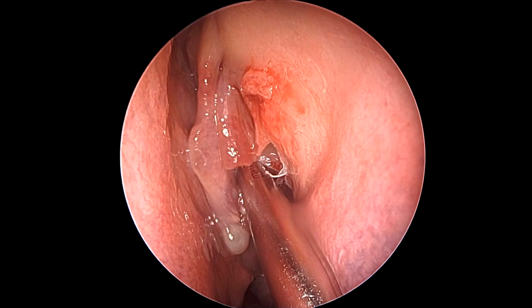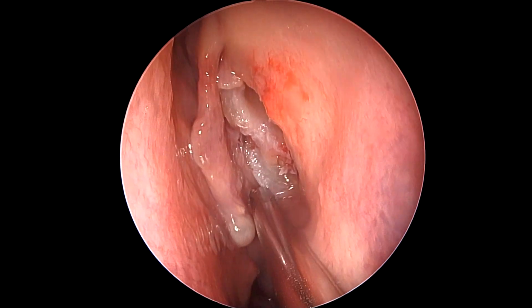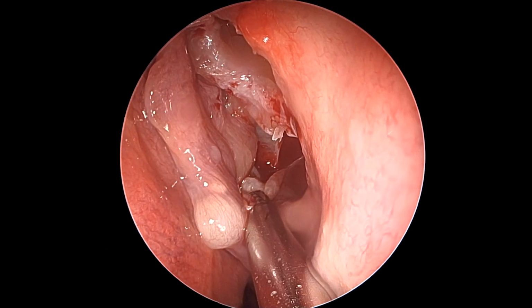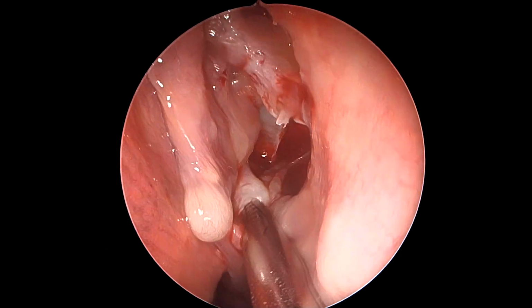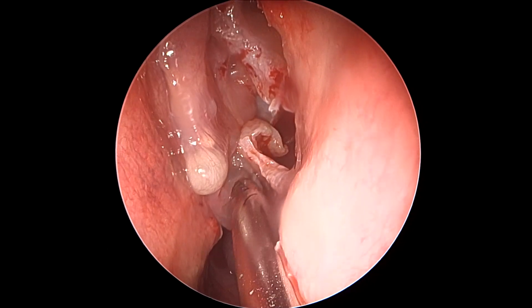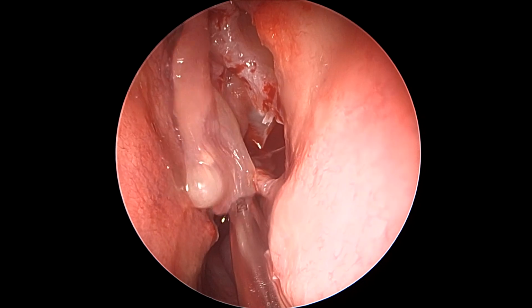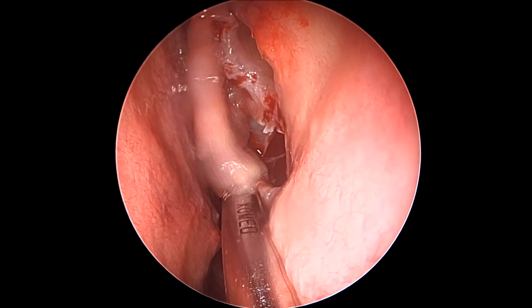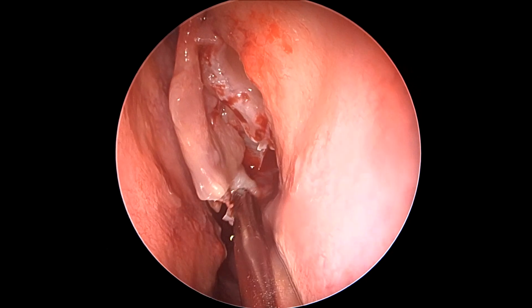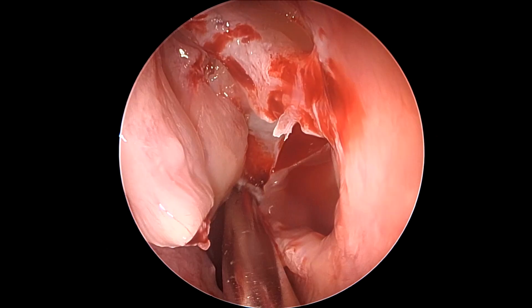We begin the same procedure on the left side. We can see polypoidal tissue here inside the middle meatus, which has already thinned the middle turbinate considerably, as seen. So we begin with our uncinectomy, the maxillary antrostomy, and some polyp removal from the middle meatus before we proceed to the anterior ethmoidectomy. And this is a polypoidal and very thinned atrophic middle turbinate because of the pressure from polyps. So we are just reducing it slightly in the inferior half while not traumatizing the superior half.